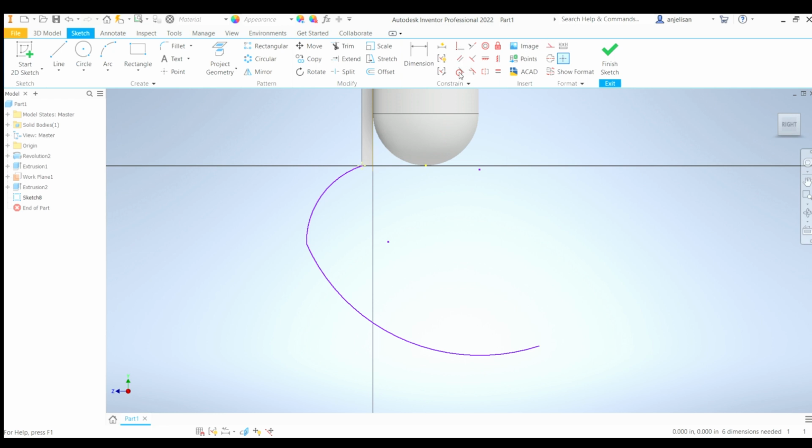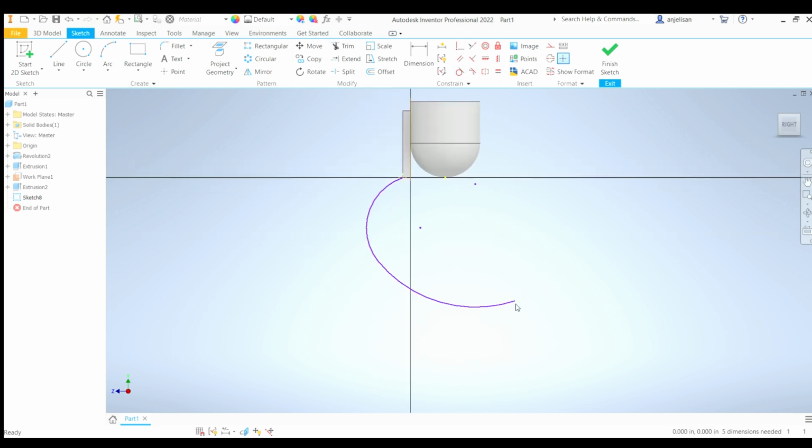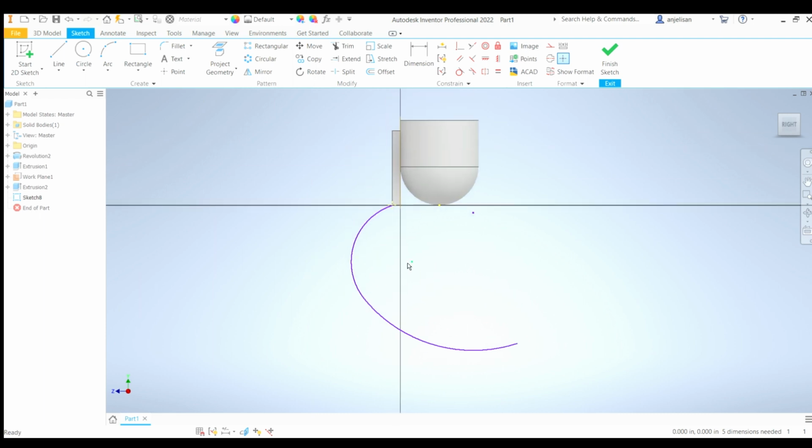Let's constrain it. This is the second constraint feature I was talking about, tangent. You can see there's a bit of roughness, a bit of jaggedness here. So we're going to smooth this out by hitting the tangent constraint and clicking on the two arcs we made. Now it's a lot smoother, you'll see. And you'll see that it looks a lot more similar to the J shape that we want.